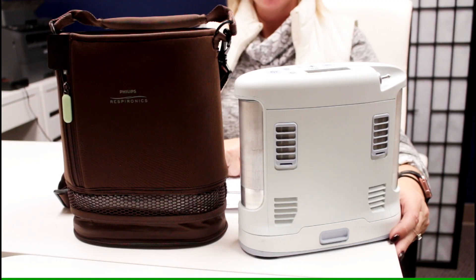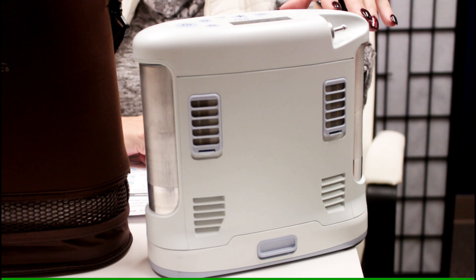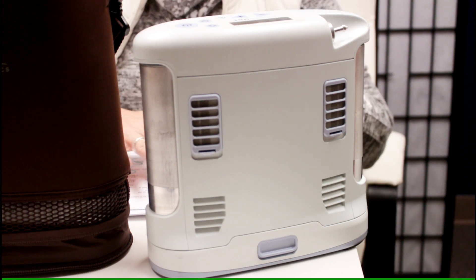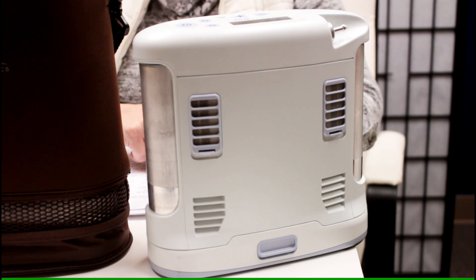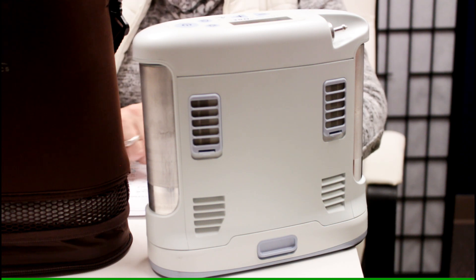The pulse flow on the Inogen 1 G3 is between 1 and 5, and the oxygen purity is 90%. It accommodates two batteries. Battery life ranges from about nine and a half hours at one liter pulse flow down to just over three hours at five liters. It is FAA approved. The operating temperature is between 41 and 104°F, and you can store it between negative 13 and 158°F — a very wide range. Humidity range is between 0% and 95%.